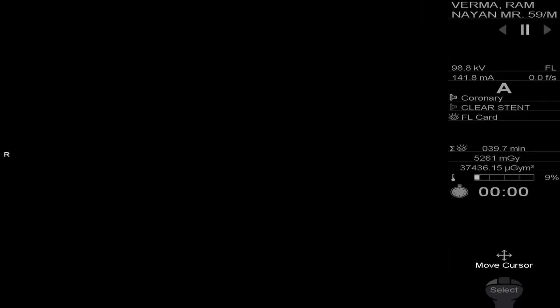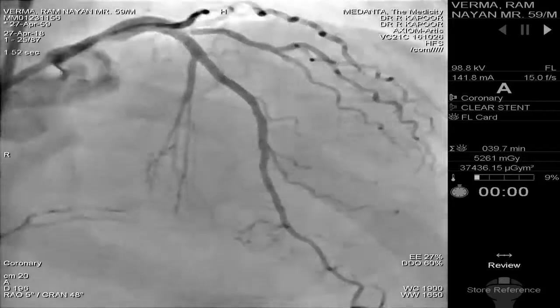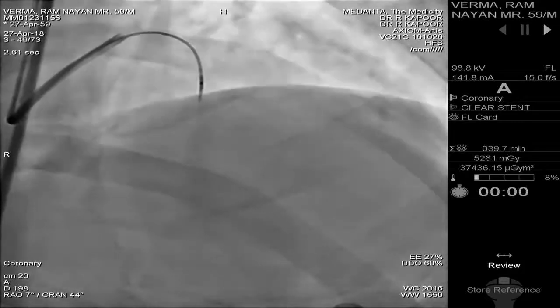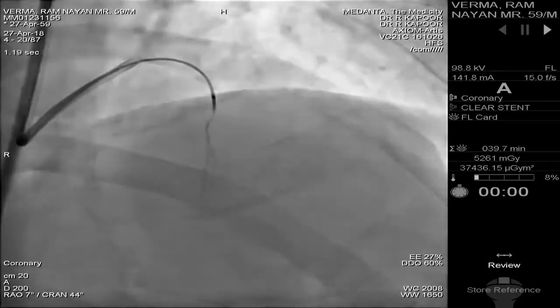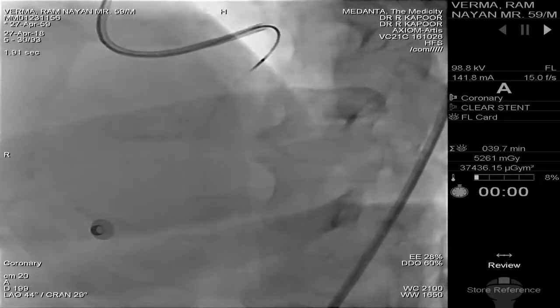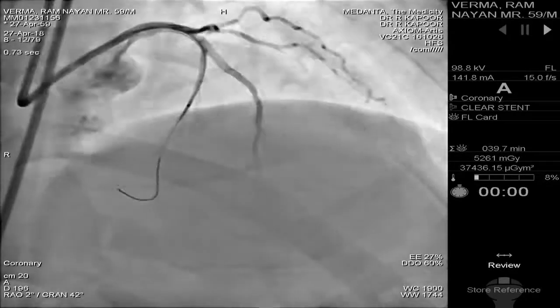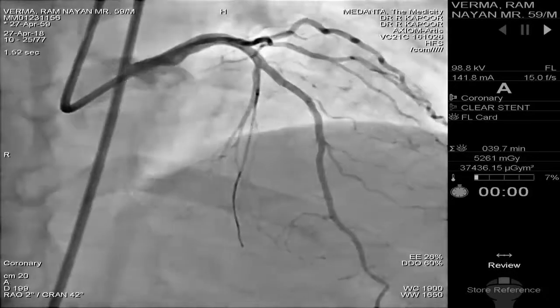Initially we thought that dealing with coronaries and putting stents in simple lesions is pretty common, so let's try this out to be shown in this meeting. Since it had failed outside, we planned a retrograde approach. We took the Corsair into the septal artery, giving selective injections. There was some collateral, but we were unable to find a concrete track. There were very flimsy small channels through which the RCA was filling. We tried various channels to enter the RCA, but did not find an absolutely concrete track.